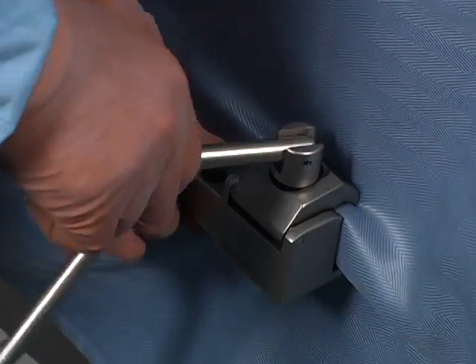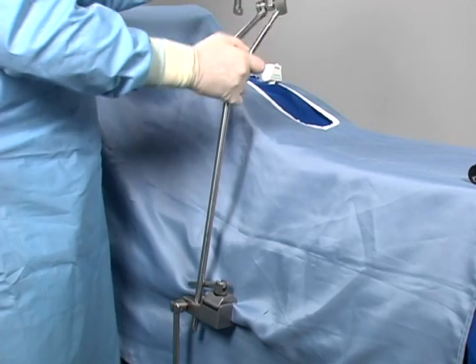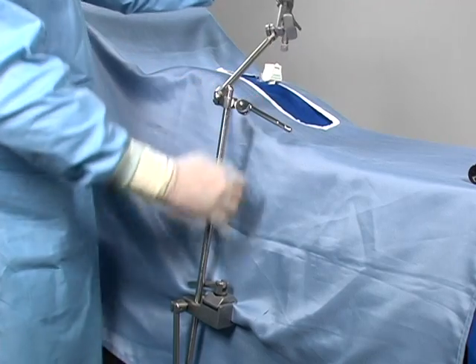Attach the power rail clamp to the OR table rail over the sterile drapes, 20 to 30 centimeters inferior to the port side, on the side of the primary surgeon. Secure the upright post to the rail clamp.